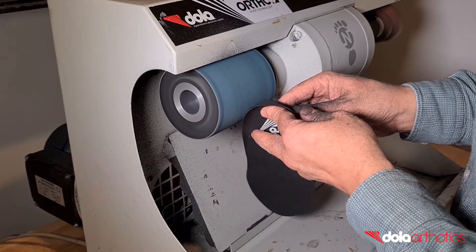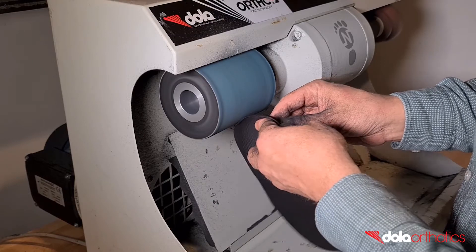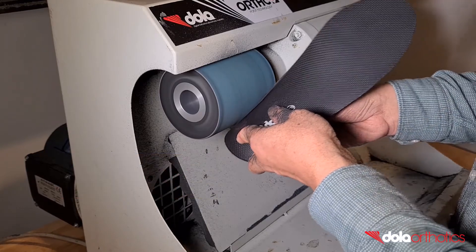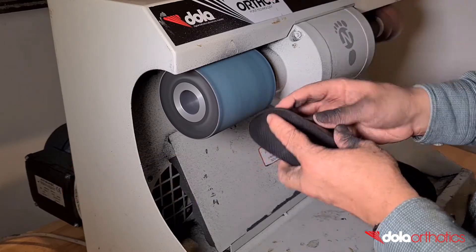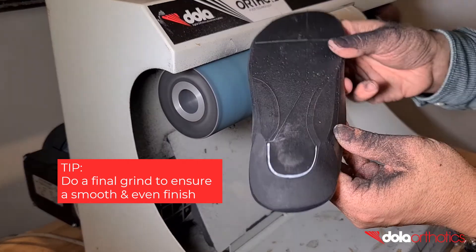Remove small sections of the orthotic at a time until you become comfortable and check your progress against the guidelines. A mild grind will keep the majority of the rear foot post in place and result in a small change in the taper angle. An aggressive grind will reduce a greater amount of the flat plantar surface and increase the taper angle. A full sweep of the edge against the grinder will ensure a smooth and even finish of the taper.